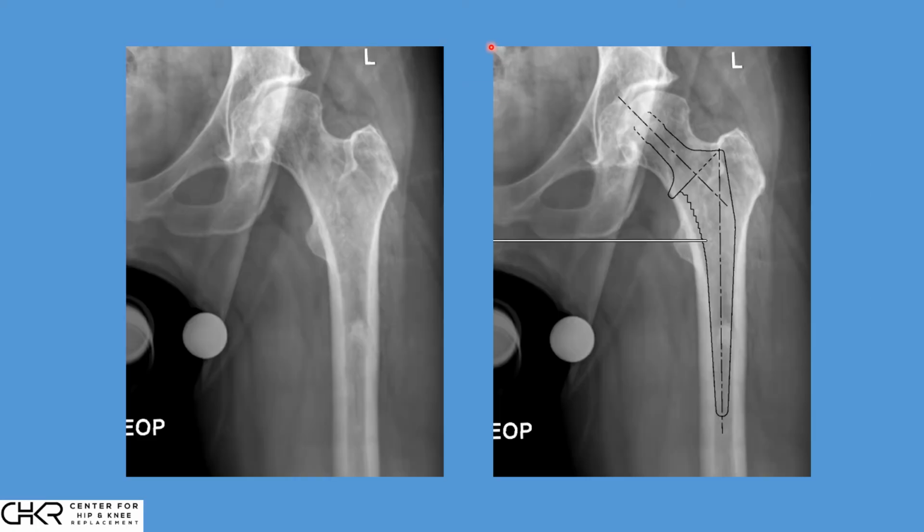The third major obstacle is organic or biological. And rather than having mechanical issues like a plate and screws, there is an internal biologic obstacle that blocks the path of a potential stem. These are a little bit more subtle, but they're actually more complex because, as you can see, they block the internal canal. And I'll show you how we manage this.